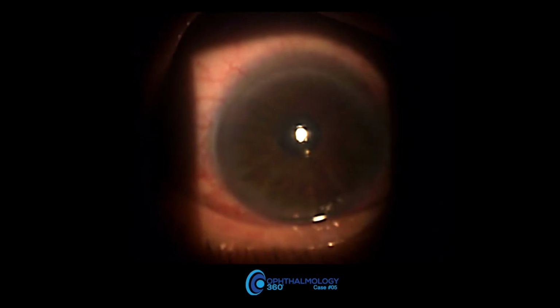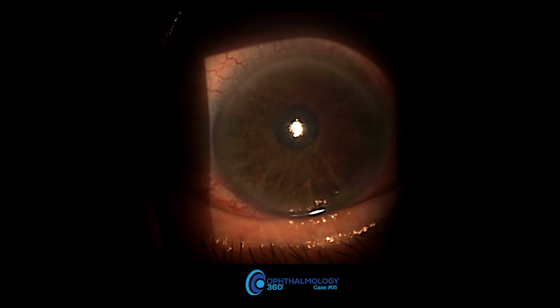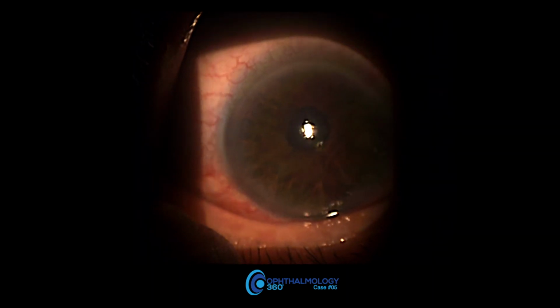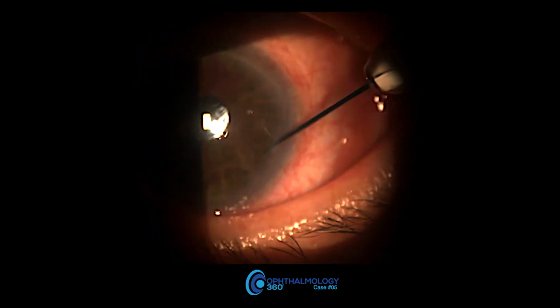This is interesting because it's a right eye, and I'm going to do a nasal injection. You can see that I like the nasal injection sometimes for the left eye, the patient's right eye, because I'm using my dominant hand, but if they don't have a large nasal bridge, I can get a really acute angle for the injection, and then I can use my left hand or finger for counter pressure without having to use a Q-tip.